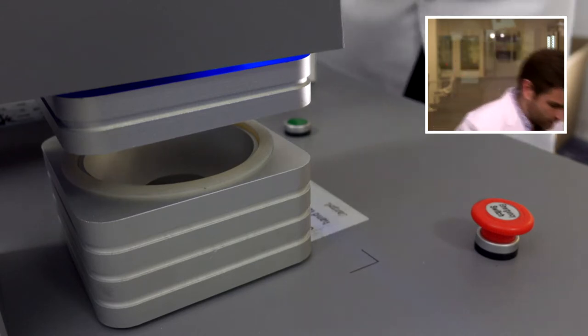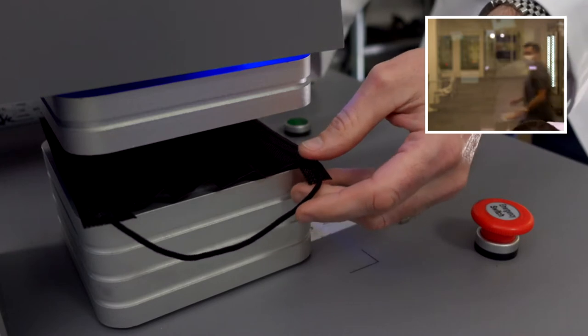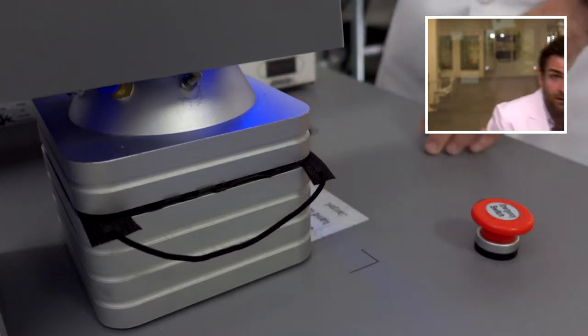Welcome back, where we are testing every single mask on Amazon. Today we are testing your favorite brand, Dio Las Vegas — or D-O-L-V. Maybe it's Dio Love, but for me it's going to be Dio Las Vegas. Let's get this in the machine and see what happens. This is what Elvis would wear if he were protecting himself from coronavirus.